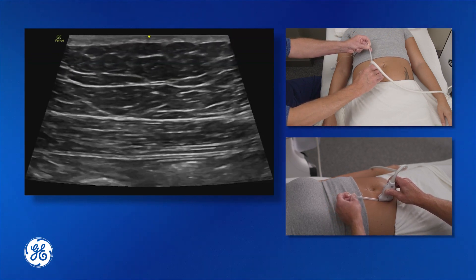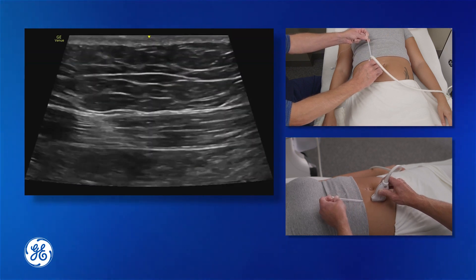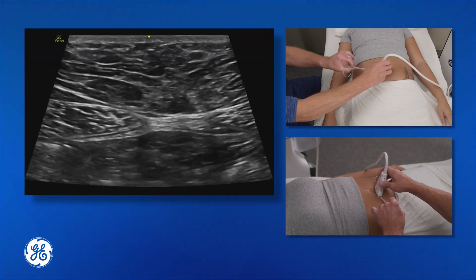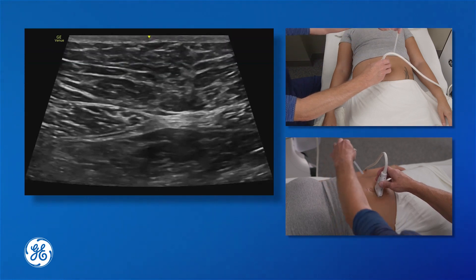For a larger midline incision we can cover a larger span using the paramedian approach, as opposed to a small umbilical incision or umbilical hernia repair where we can use the lateral-to-medial approach on both sides of the probe.